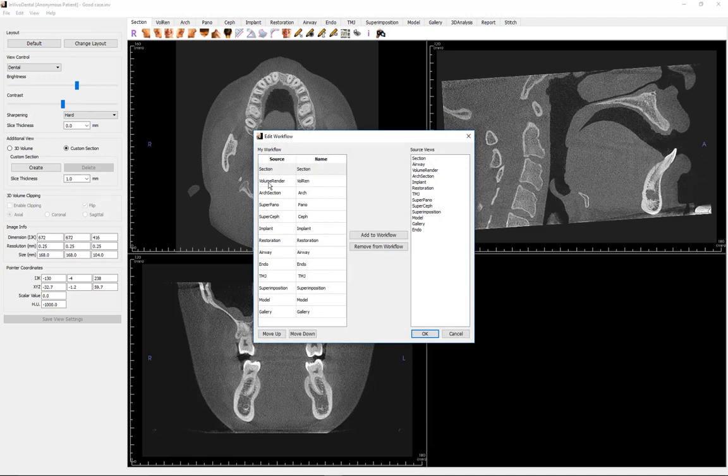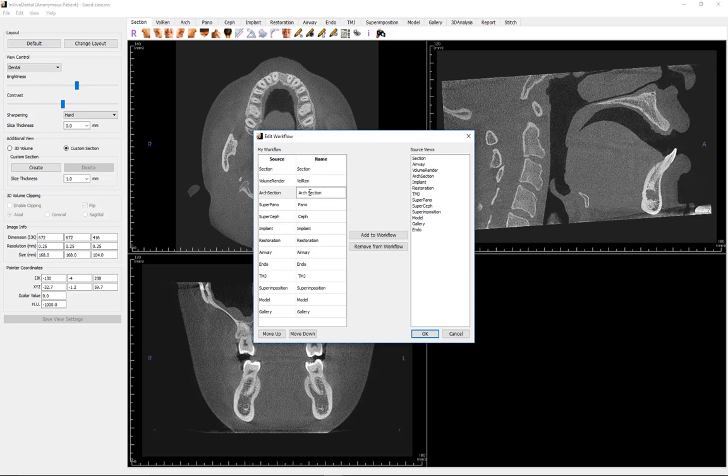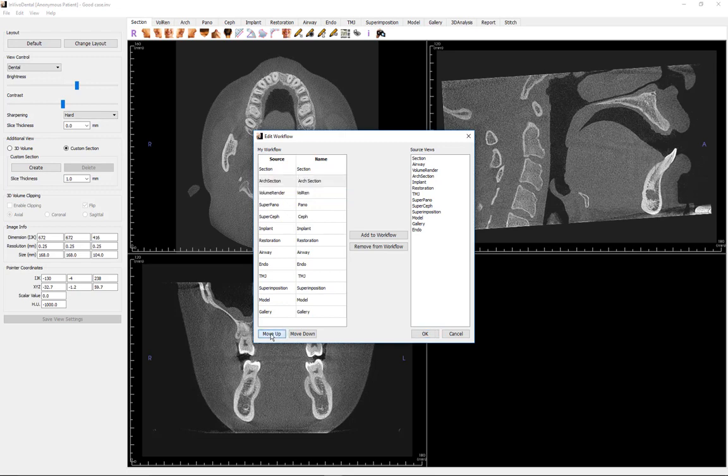A view tab's name may be edited by clicking on its name and changing it. You may also change the order of the tabs on the toolbar. For example, you might want to begin your case planning by viewing a panoramic and the cross-sectional slices in the Arch View section tab, rather than the default section view. Therefore, it might be more efficient to relocate the Arch section view tab to the beginning of the list so it will open when the case loads into the software.